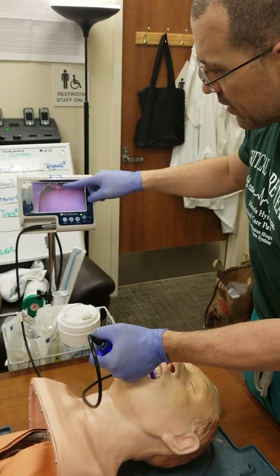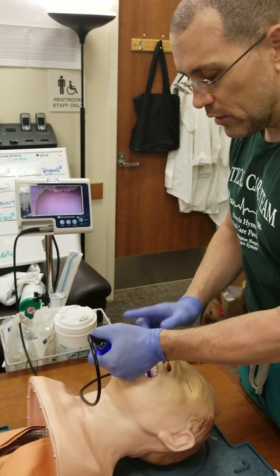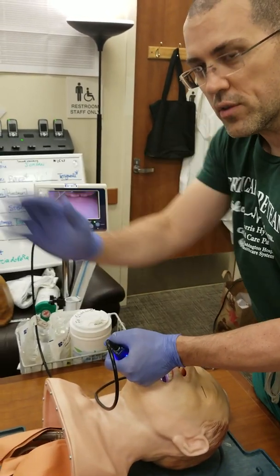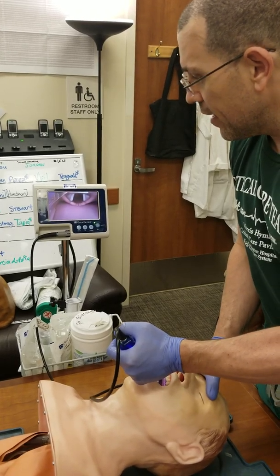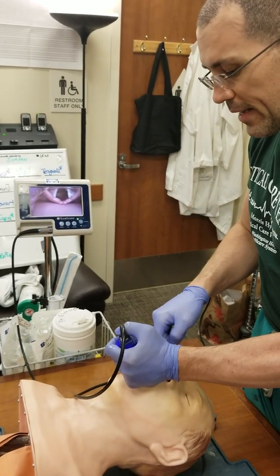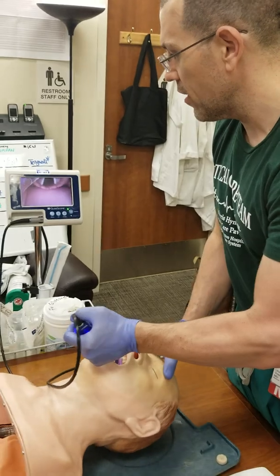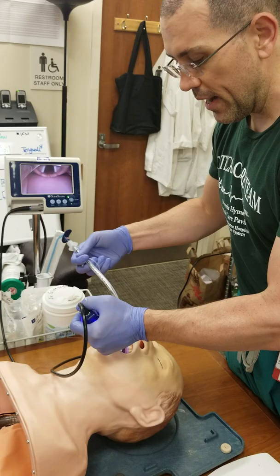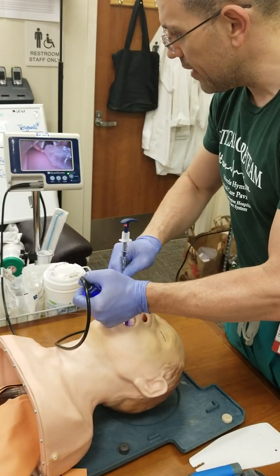You can see that you can barely start seeing some of the glottic opening. In all intubation techniques, you're taught to pull up at about a 45-degree direction toward the ceiling — not rock it back, because that damages the teeth. I literally just lift the whole thing up in that direction. Now when I see this opening, I take the ET tube, come in at the corner of the mouth, and advance it right into the opening.